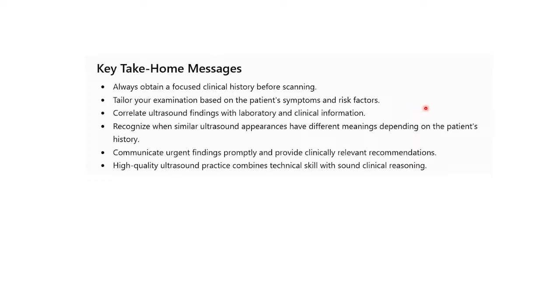Recognize when similar ultrasound appearances have different meanings depending on the patient's history. Communicate findings promptly and provide clinically relevant recommendations. High quality ultrasound practice combines technical skill with sound clinical reasoning. Ladies and gentlemen, I think the message is so clear to all of you.